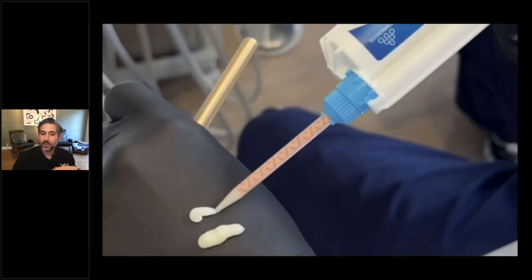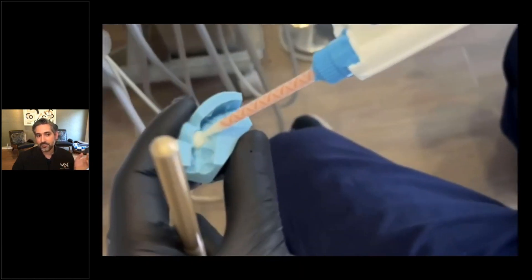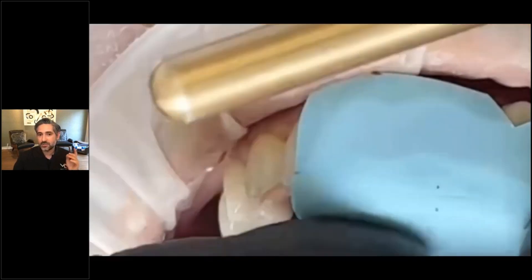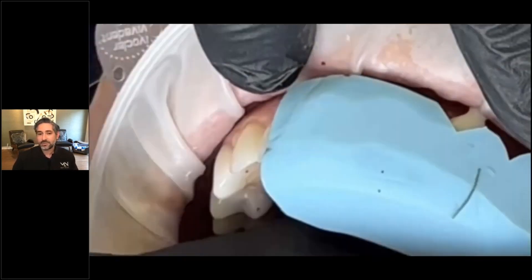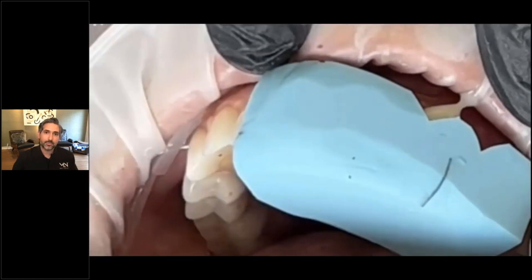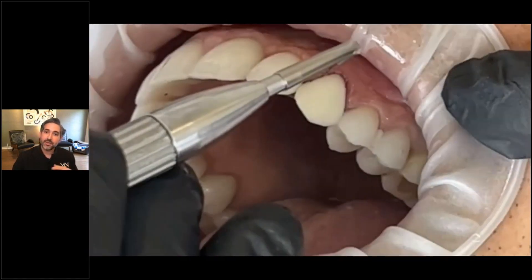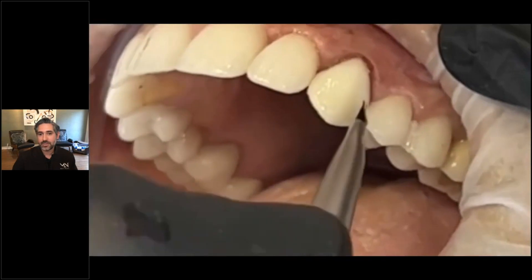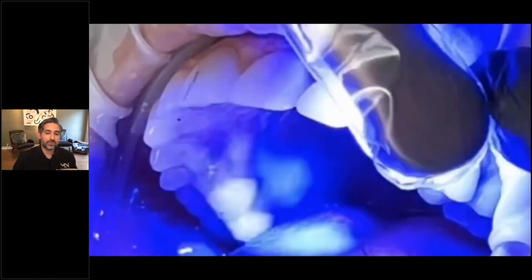My assistant made the putty. I've been working with her for a while to make a variety of different silicone putties, so it's really nice to be able to delegate things like that. Now I have the provisional and I'm filling it with Vasalis, which is a very strong PMMA. This patient is known for breaking other restorations, so I want something strong. I fill it, put it in — I Vaseline the tooth ahead of time because I did immediate dentin sealing. If you don't Vaseline, you'll get adhesion, and that will not be pretty on cementation day. You Vaseline to create a separation, place the material in there, and then you can remove the excess.